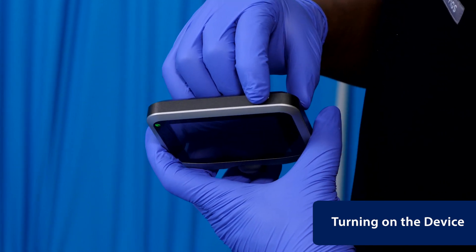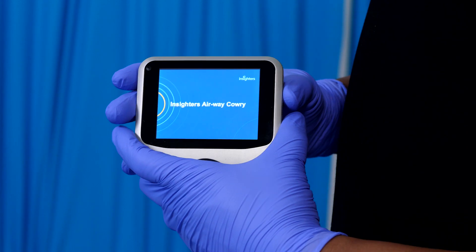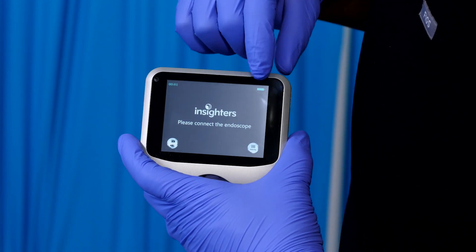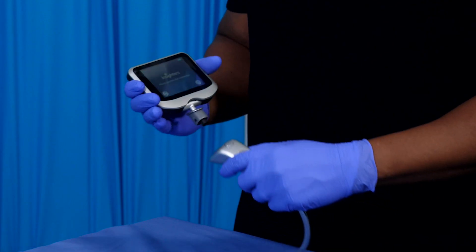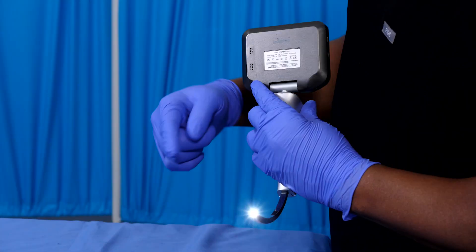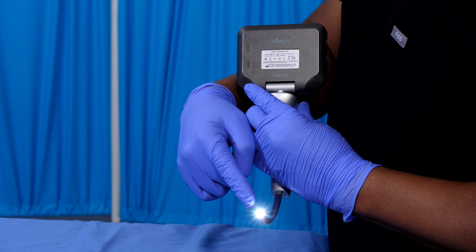Press the power button on the screen to turn on the device. Check that the battery is sufficiently charged. Connect the handle to the screen. The light on the distal end of the handle will light up and the real-time anti-fog system will automatically start.